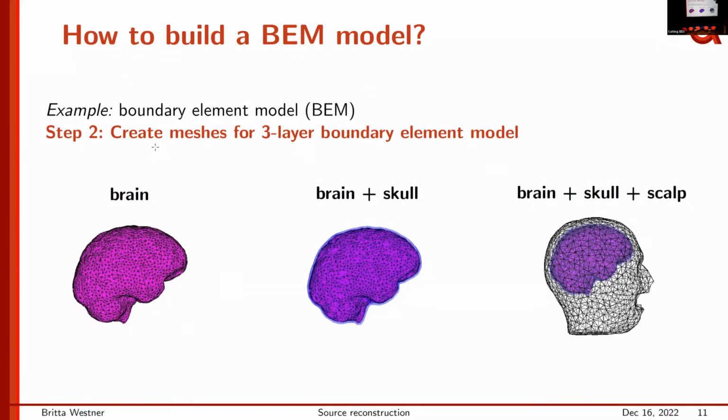And so now we have this model, right? Based on our MRI, we get all of this information from the MRI. So if you think about it, obviously, this is in whatever coordinate space the MRI was originally in, right? So the MRI scanner has a coordinate system. You can think of it a bit as a room, the MRI room, and we have never left this room. So all of those models are in this MRI coordinate system.